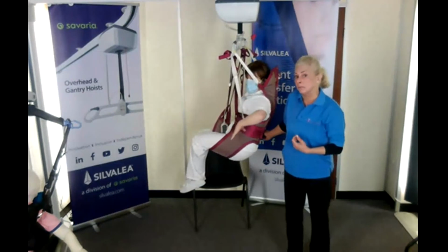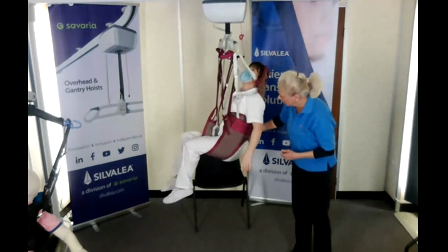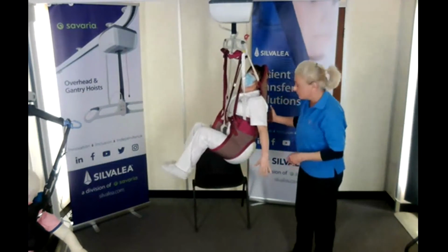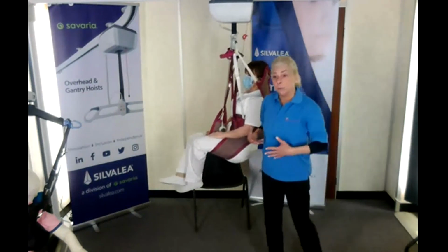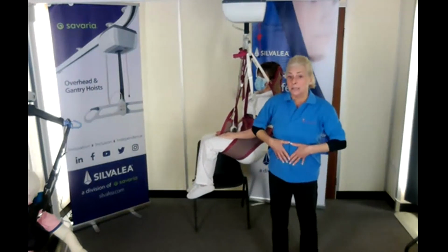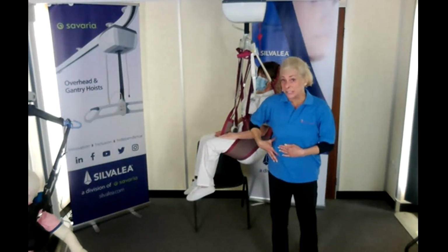So we're looking at someone with really poor tone. So if Jude, can you relax totally? Can you try and flop through? Yeah, bring your knees up. No, she's very contained within it. Very contained, because it is firm. So you would need to think about whether, if someone doesn't like being restricted, then it might be too fitted.